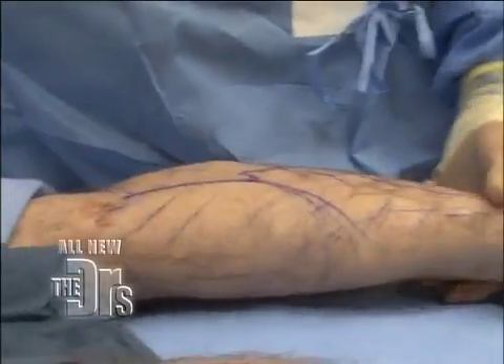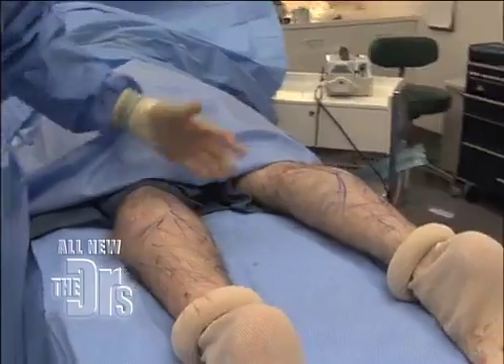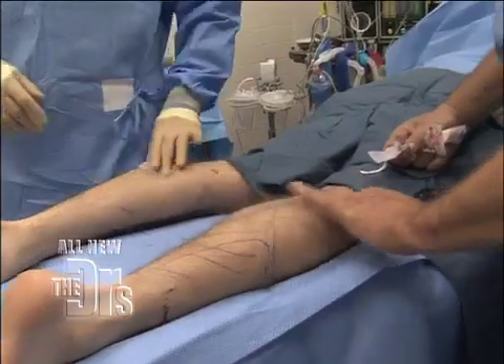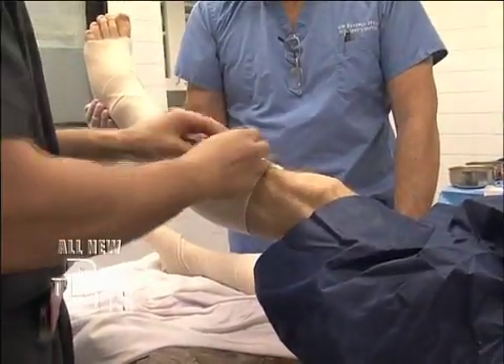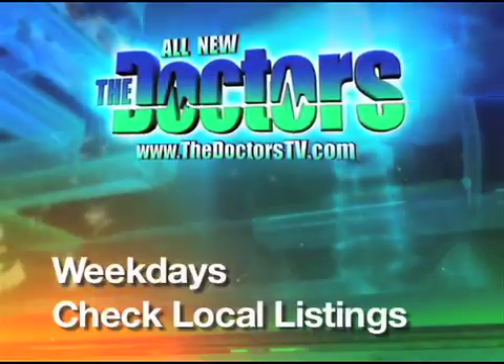He's actually awake so he can flex that muscle. Point your toe for me. It's looking good. We're finished up, and you can see there's definitely a difference. No one will ever be able to tell that he had anything done. And when he flexes, they'll look just like his regular calves. Can't wait to see it. I'm very excited.